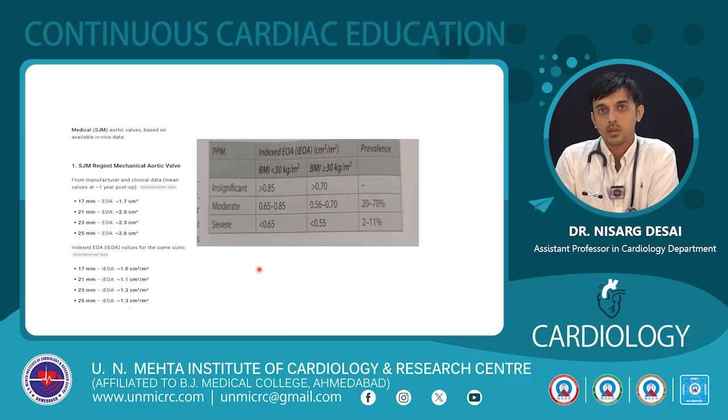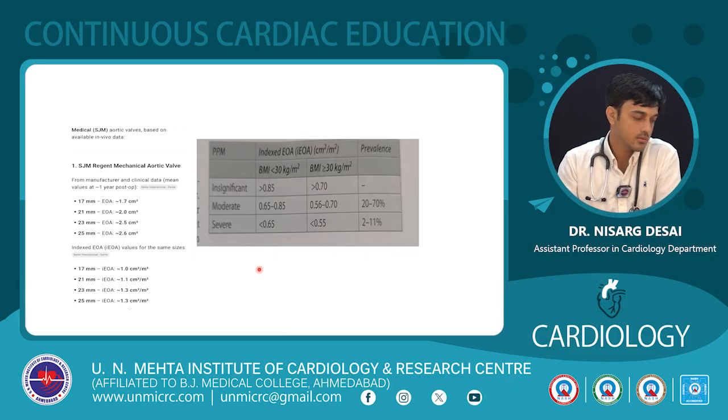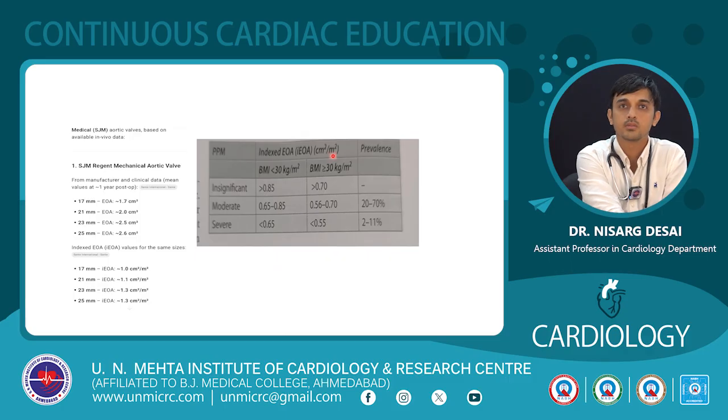So this is a short table as studied: the prevalence of moderate PPM is about 20 to 70% and severe is about 2 to 11%. And this is for the aortic valve. As we can see, if the body mass index is more than 30, so the patient is obese, the cutoff value is EOA divided by body surface area.